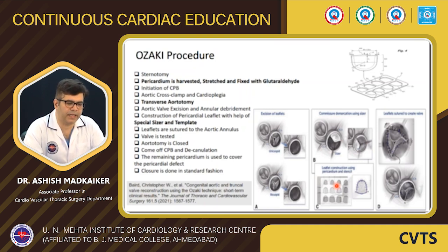Now, when it comes to AVR in adults, we have a lot of choices of prosthesis and techniques, but in the pediatric age group it is challenging because of the limited availability of valve sizes. The Ozaki procedure has really made things different in this age group. It is safe, effective, reproducible, and has shown very good intermediate and long-term results in terms of freedom from reoperation, AR, and other major adverse events.